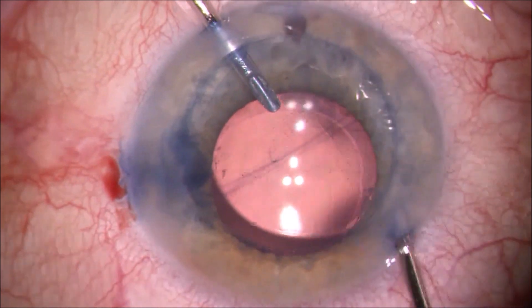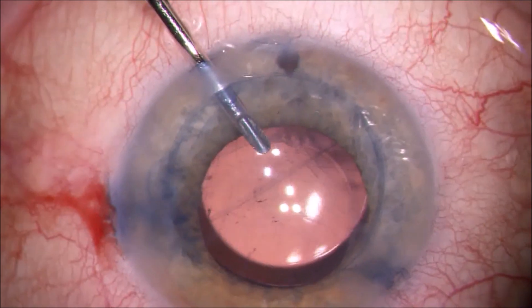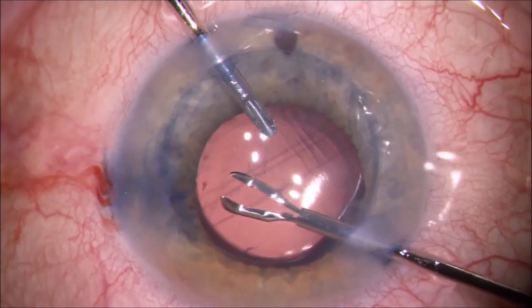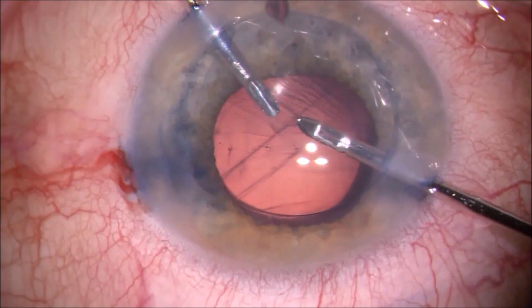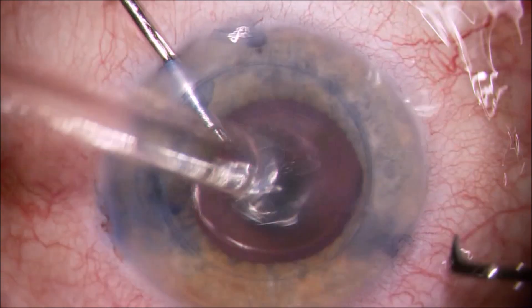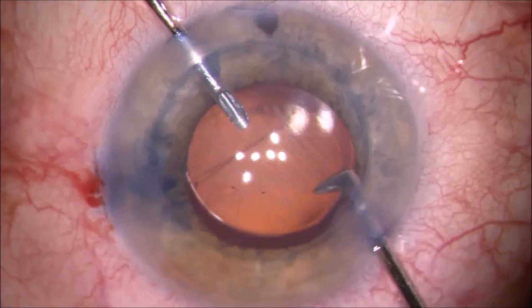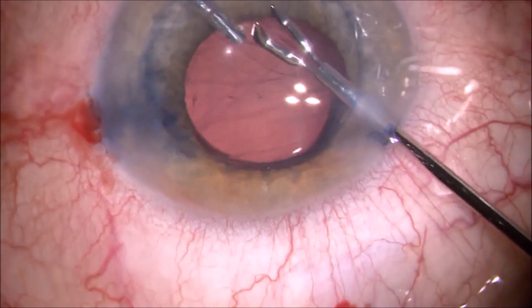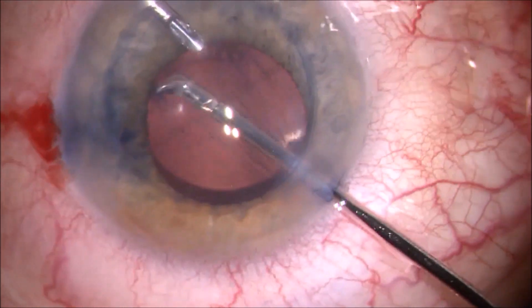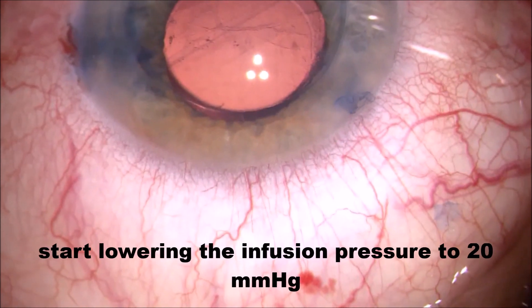With remnants that are still connected to the stroma, or if you are within the stroma and see stromal remnants, I would always suggest leaving the stromal remnants in there, because the patient isn't really affected by that and you can only cause harm and scarring if you try to remove them. If you have an IOCT at hand, it can be very handy in cases where you're not sure if remnants are left, if trypan blue isn't staining well, or if you need to confirm whether you're within the stromal part. I will put up an extra video regarding IOCT use in DMEC surgery.